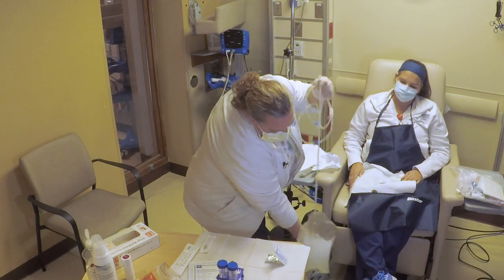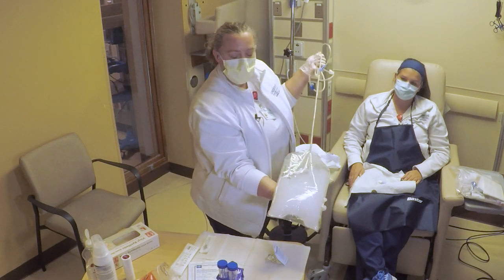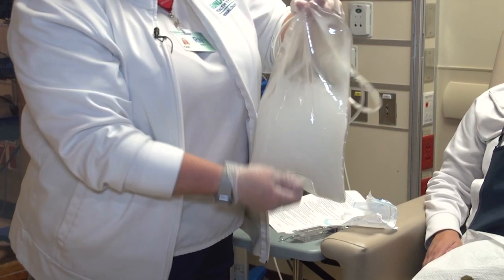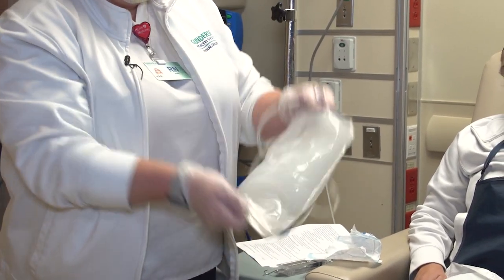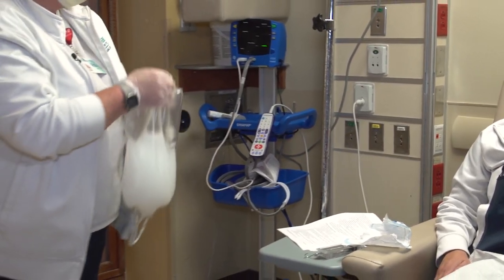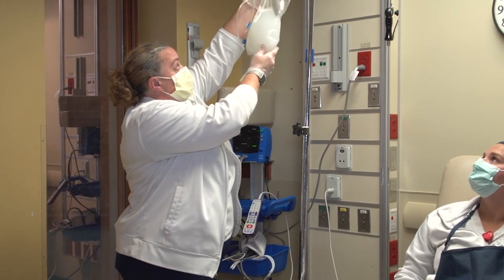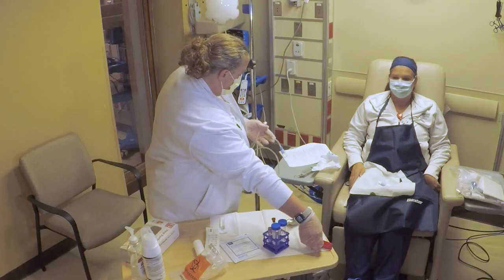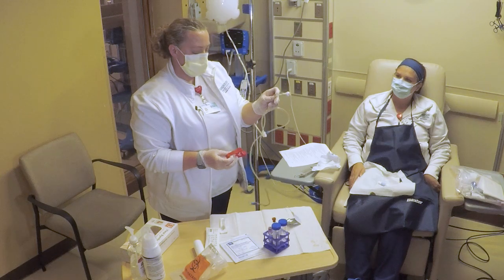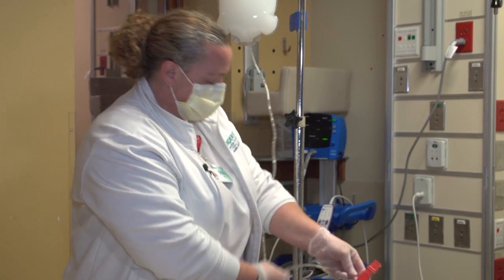Then you take a look at your drainage. If you can see through it, we call it clear. This is quite cloudy. Before you take the sample, we want you to slowly mix the sample. I find it best to hang your sample back on the IV pole. Have one red clamp. The line that you disconnected from your patient, I recommend just putting a red clamp on that. It'll make things easier for you.